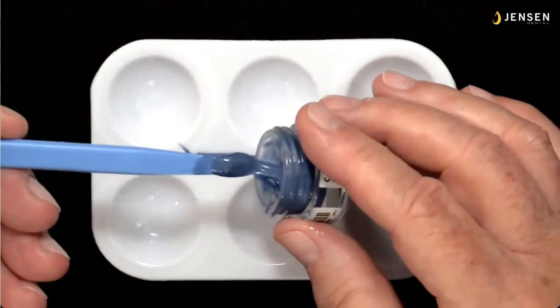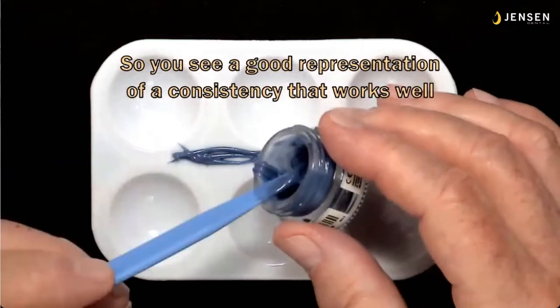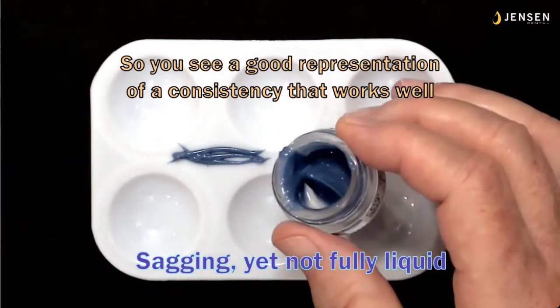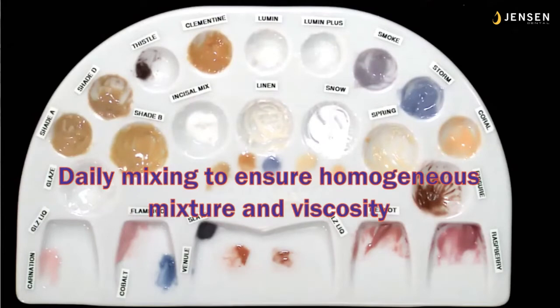Now we don't want it like liquid. If it flies out there just like a liquid, like paint pouring out of a can, it's too loose. So you see a good representation of a consistency that works well, sagging but not fully liquid. We want it to have kind of a honey or a molasses type consistency.